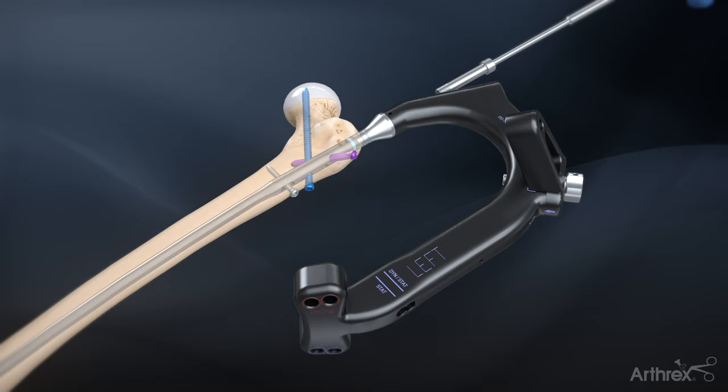Finally, use the ball hex driver to uncouple and remove the targeting arm from the nail.